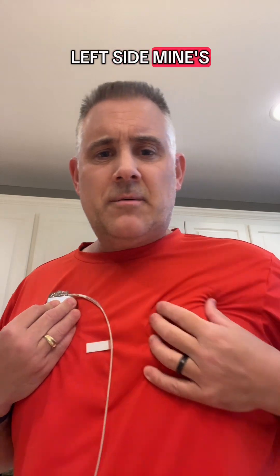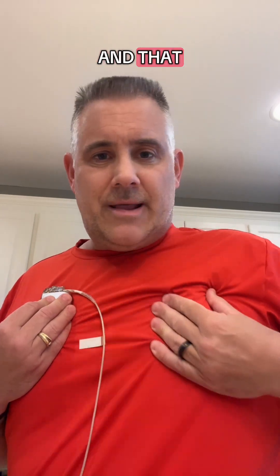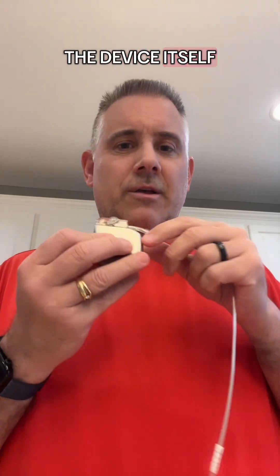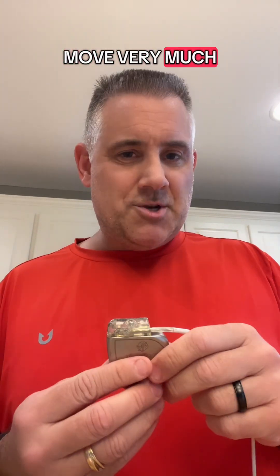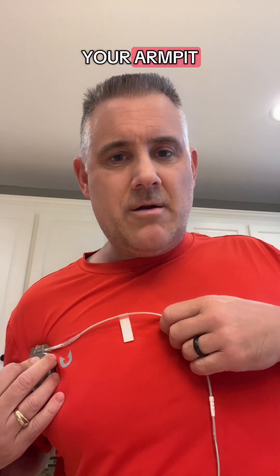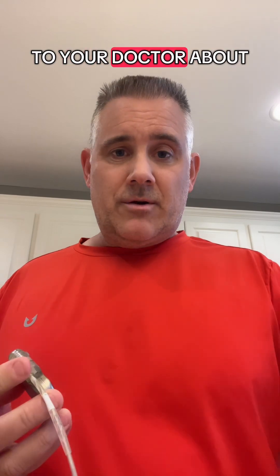Mine's on my right side — and I can move it around, and that doesn't hurt. It's attached to the muscle, it's under the skin, and the pocket they form is usually not much bigger than the device itself, so it shouldn't move very much. But if you can slide your device up to your collarbone or over into your armpit, that's a problem and something you should talk to your doctor about.